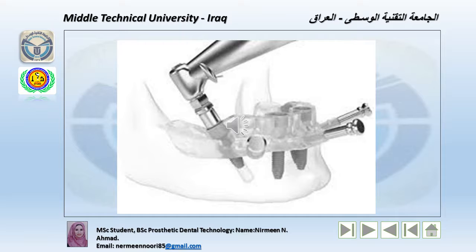This technology has been widely used with significantly proven success in achieving optimal aesthetic and functional results. Guided surgery may be considered a viable alternative for the rehabilitation of the edentulous space within the correct indication. The highlight of this technique is the detailed planning necessarily performed prior to the surgery, a fact that should be routine and should be performed in all clinical situations.